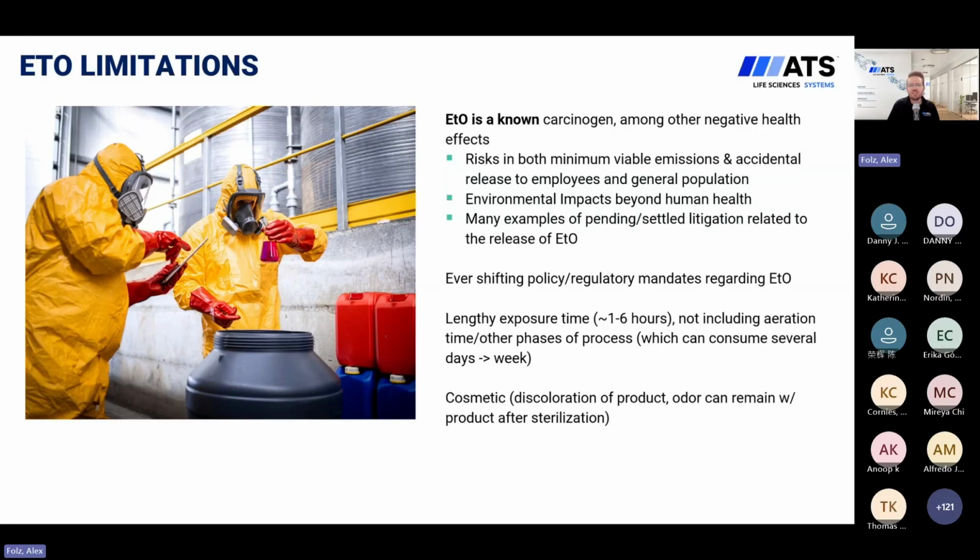In addition to that, there's a lengthy exposure time, approximately 1 to 6 hours of exposure to the ethylene oxide. There are also several other phases of the process, including aeration, which can sometimes take days, if not a week, for ethylene oxide sterilization. Finally, there can be some cosmetic impacts to the product.